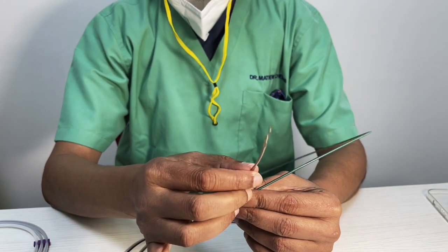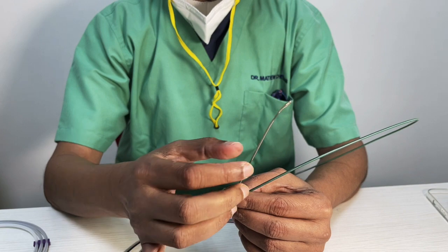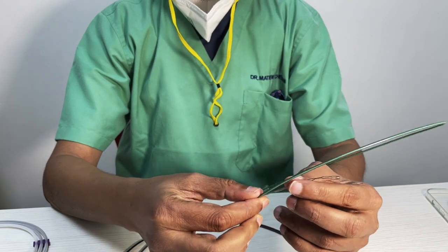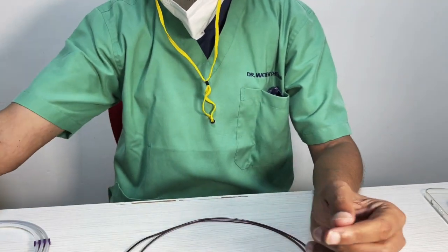It looks pretty disastrous, I know. And I know that the Penumbra may not be happy showing you this demonstration, but the bottom line, you must know this is the problem. So even when you insert it inside, remember, this is a problem that can take place.